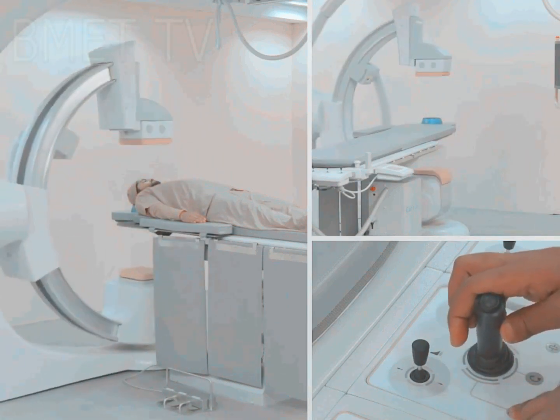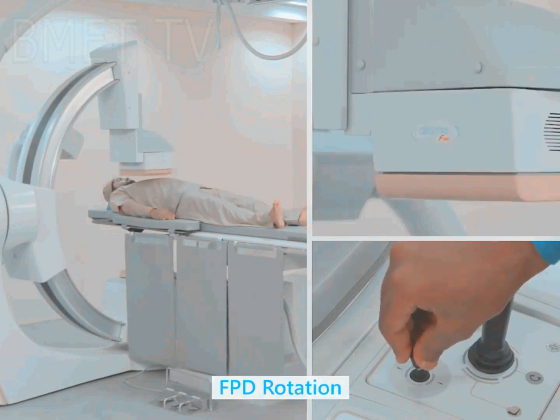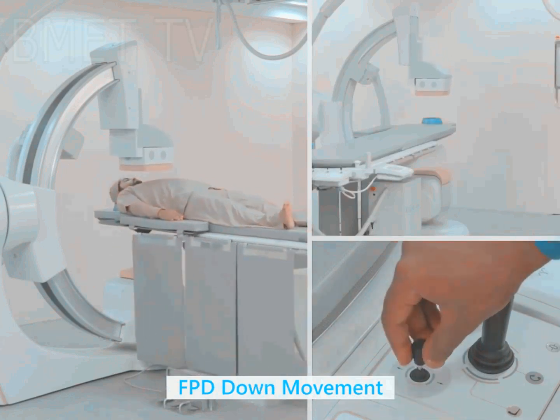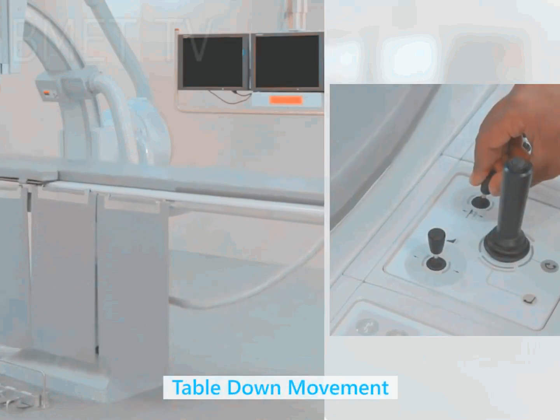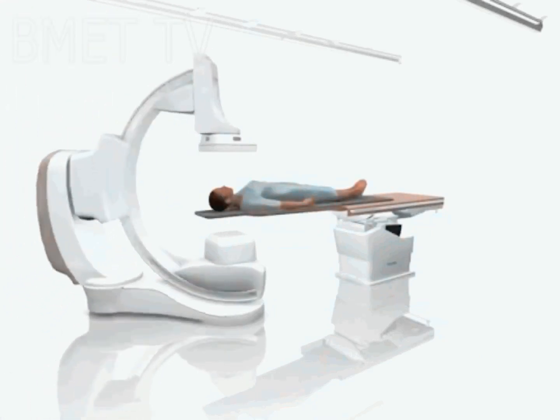Most catheterization laboratories are single-plane facilities, those that have a single X-ray generator source and a single X-ray image intensifier for fluoroscopic imaging. Older cath labs used cinefilm to record the information obtained, but since 2000, most new facilities are digital. The latest digital cath labs are biplane and have 2 X-ray sources and use flat panel detectors.